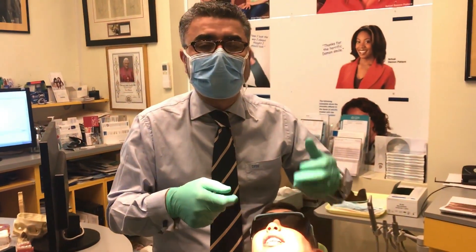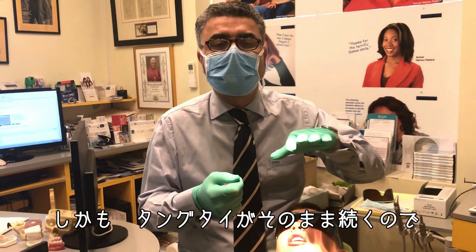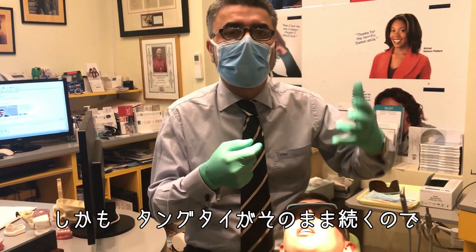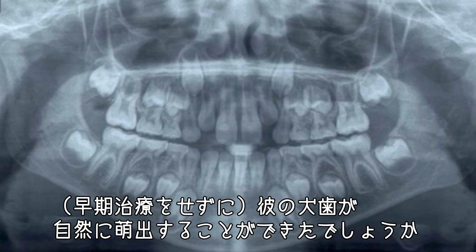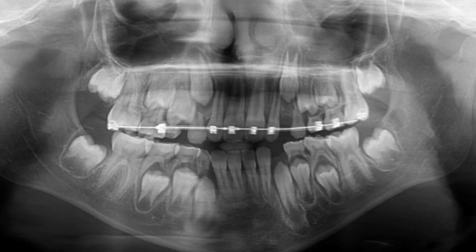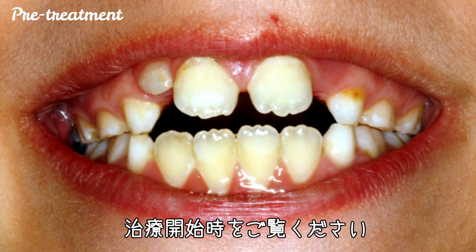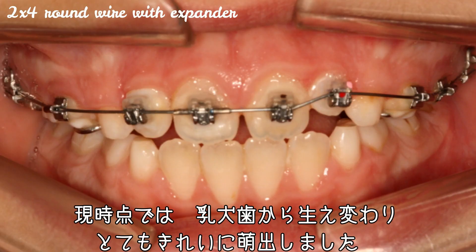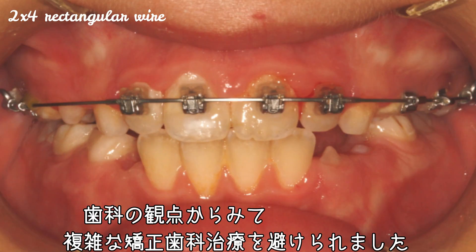And then they end up having four teeth out. They end up still being tongue-tied, which affects their oral hygiene, affects their speech, affects their swallowing, etc. That's where Steve started, right? No way those canines would have come down on their own. This is the mid-treatment x-ray after we had expanded and used 2x4. Look where it starts, look where it is. And the baby canines have fallen out now, and those canines have dropped in beautifully. So from a dental point of view, we've avoided a lot of orthodontic work for him.